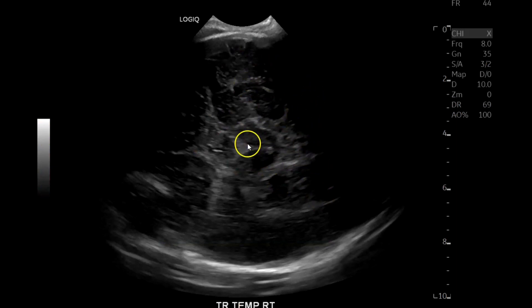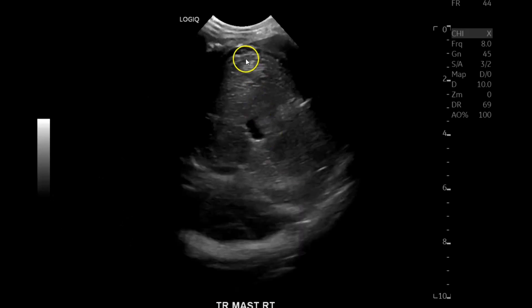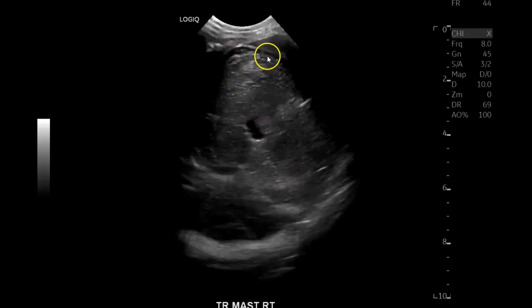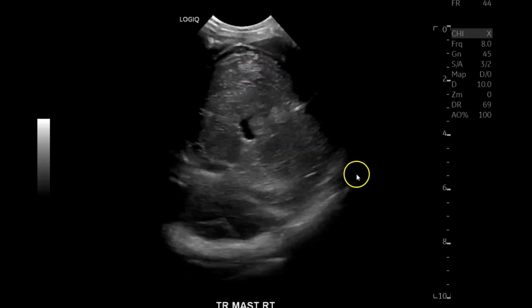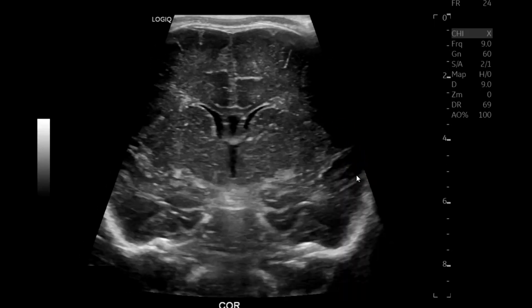In transverse temporal view you can see where the circle of Willis is going to be right there. Then mastoid view — you can see the cerebellum, fourth ventricle, and a little bit of posterior fossa fluid, which is normal. Beautiful.